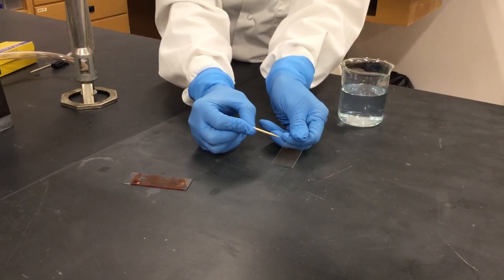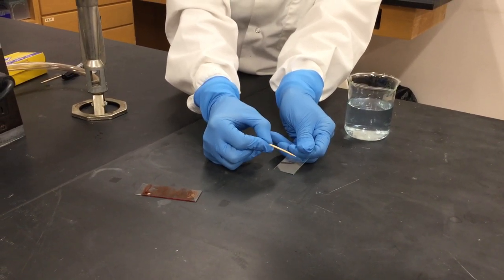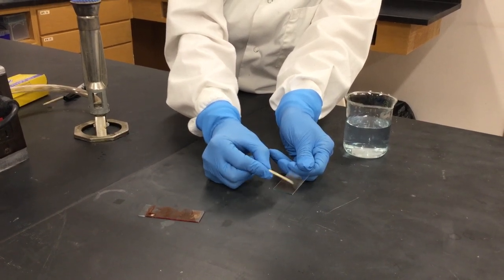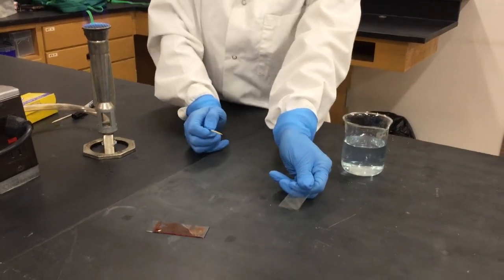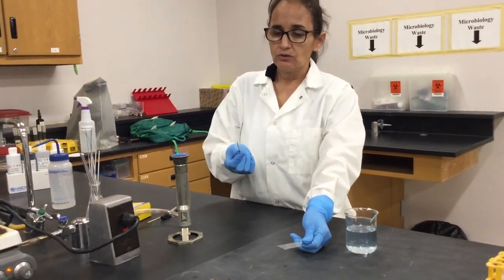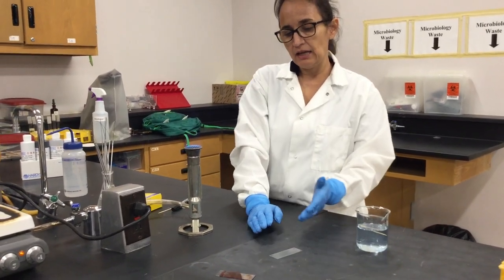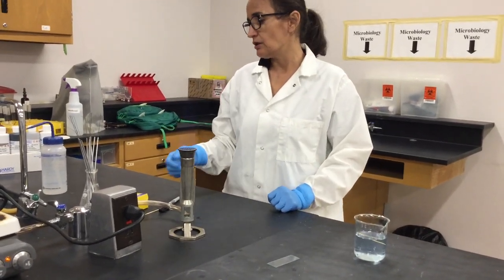And then, since you have a lot of water and you want to wait for this to dry, and you have kind of a puddle there, you can smear it to the sides to make a thin film that makes it easier for it to dry. And at some point that helps as well to distribute the bacteria to the sides, and also the debris. What do you do with this after? You put it in the beaker with the disinfectant. And then let it dry as any other smear, and once it's dry, you will heat fix, and then you start the staining.